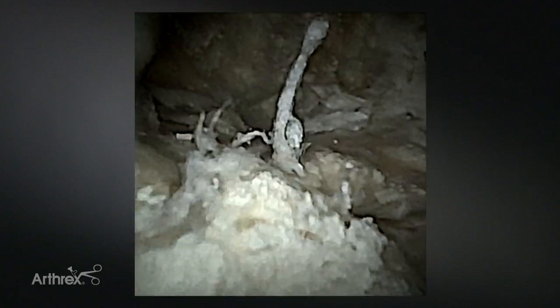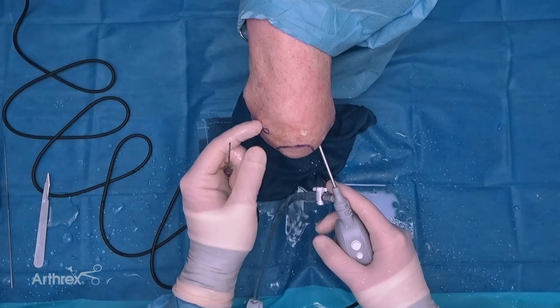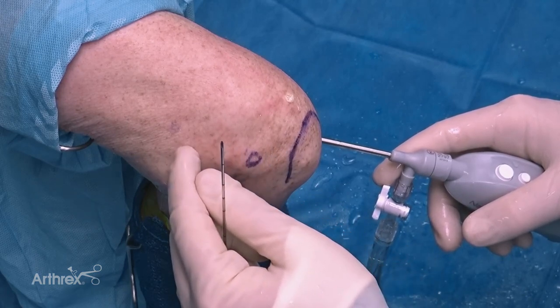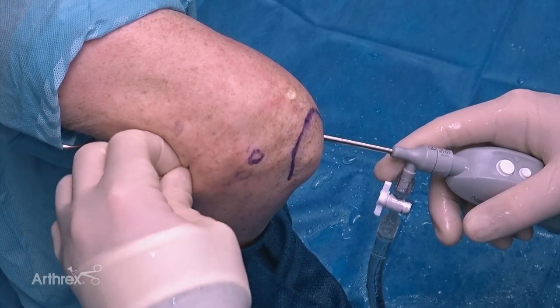Obviously if you wanted an even better view you could use the angled cannula. What this does is allow you to establish an anterior portal under needle localization rather than doing it blindly. I'm going to take my cannulated needle and come up for a standard proximal anteromedial portal - right off the medial epicondyle, up two centimeters, and approximately one to two centimeters anterior to the intermuscular septum - and come into the elbow. Now I can see that needle in the anterior joint.